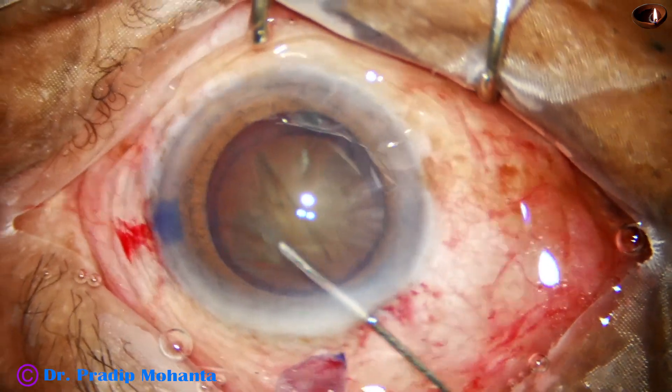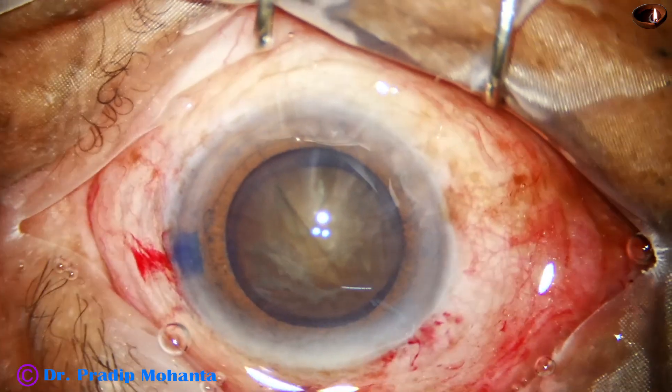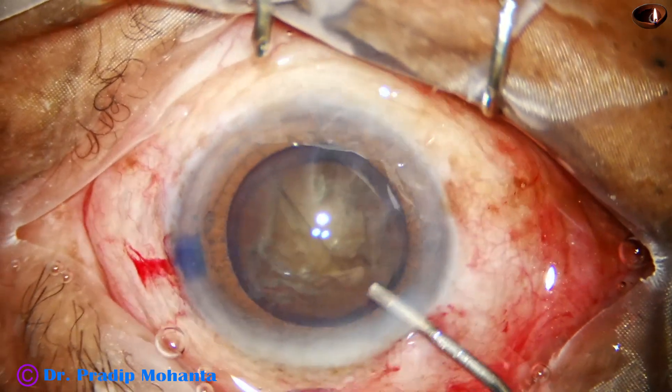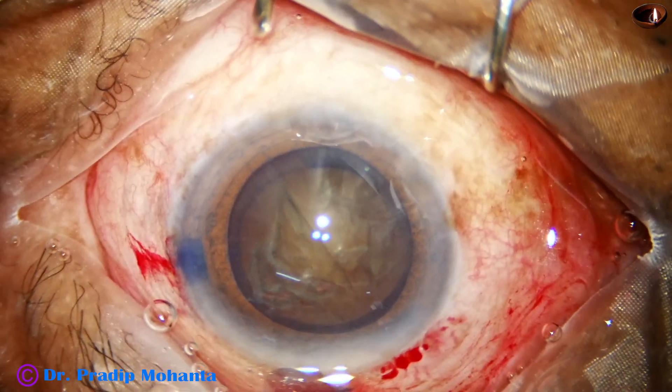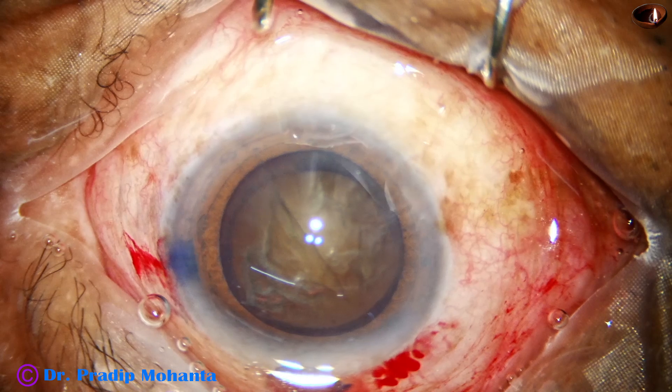Hydrodissection is done. Small aliquots of saline is injected at multiple points. Nucleus is stabbed. The nucleus is mobilized. Viscoelastic again, and now is the time to go into the anterior chamber with the handpiece.